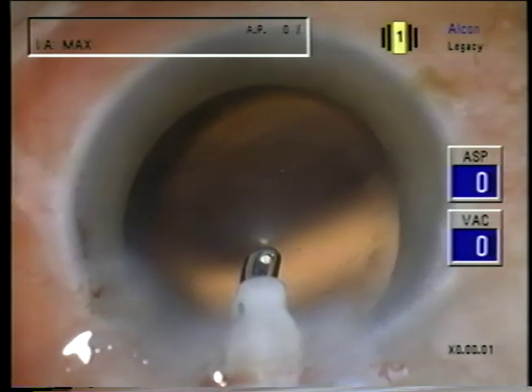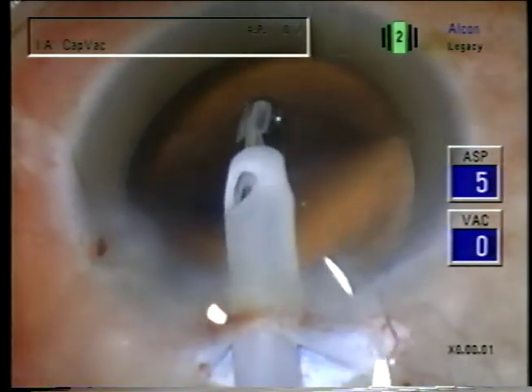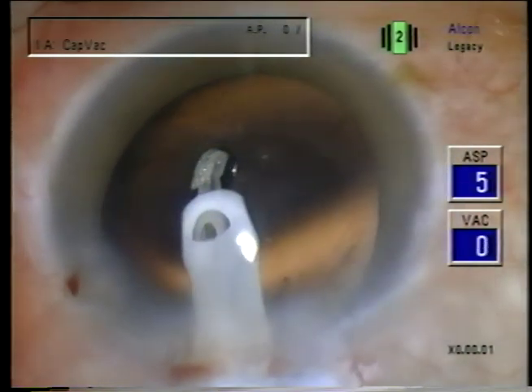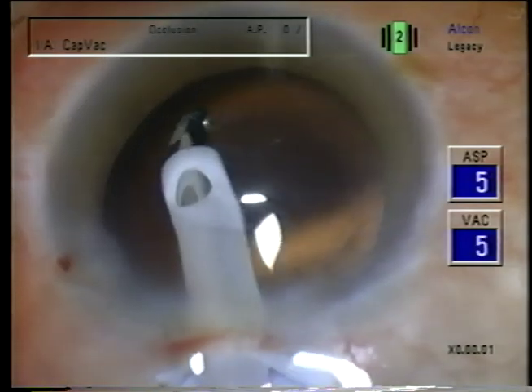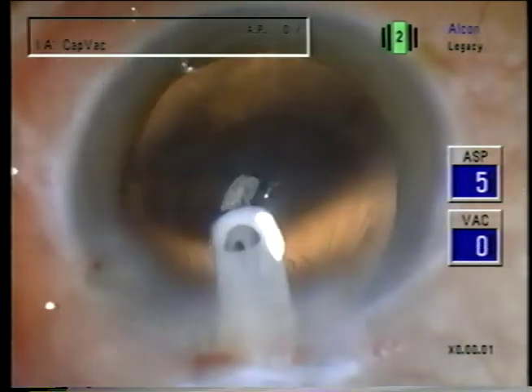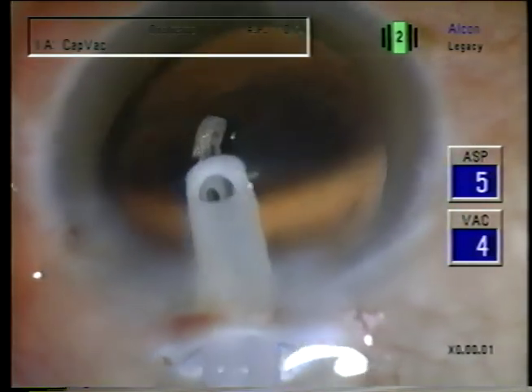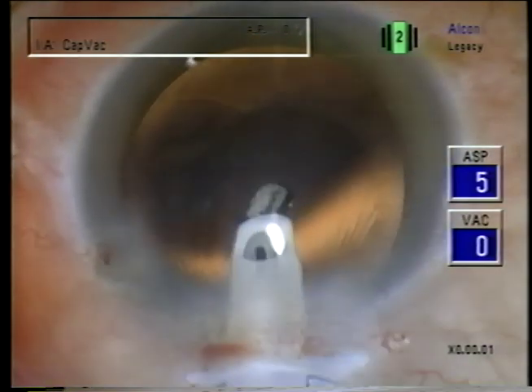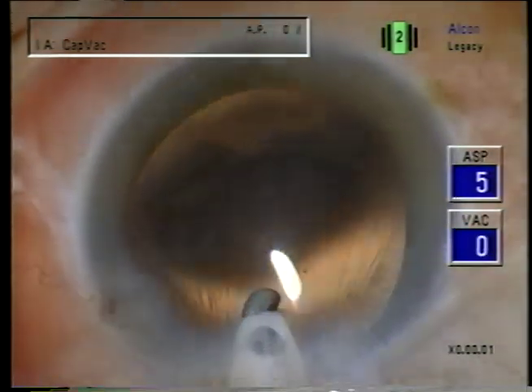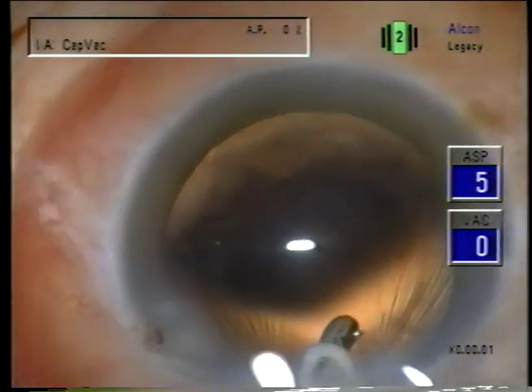Now we'll switch to cap vac to just aspirate off these little wisps of cortex, little strands. When I'm vacuuming the capsule, I move the IA tip very slowly, because even with the low vacuum, one can tear the capsule if the movement is too rapid.